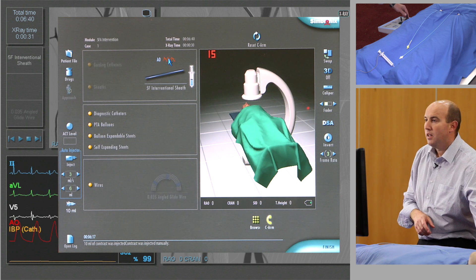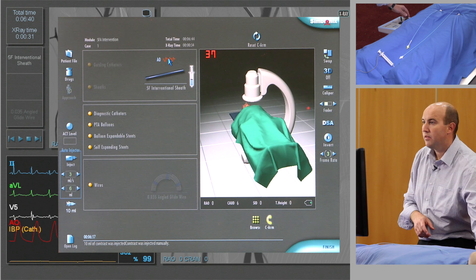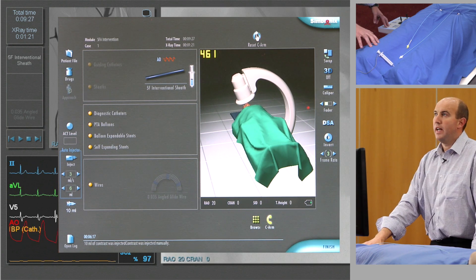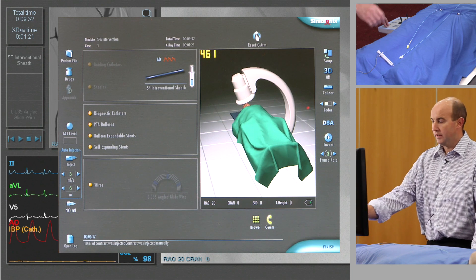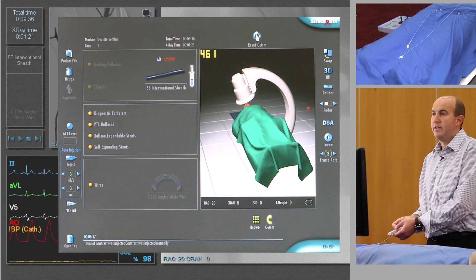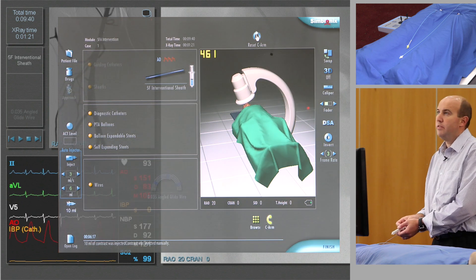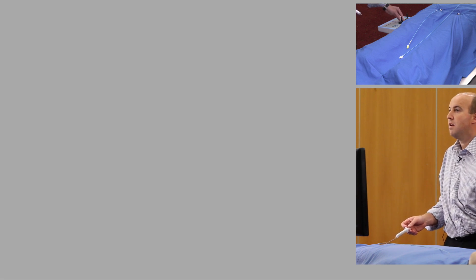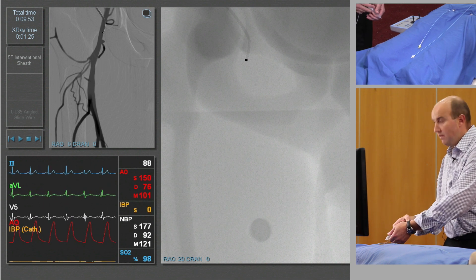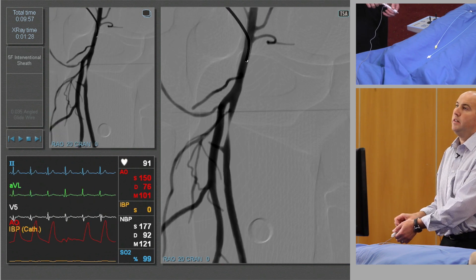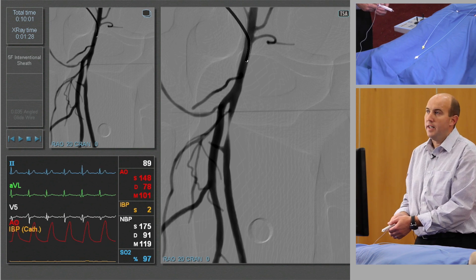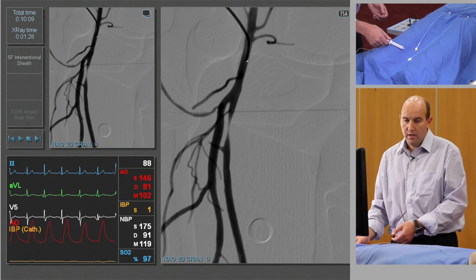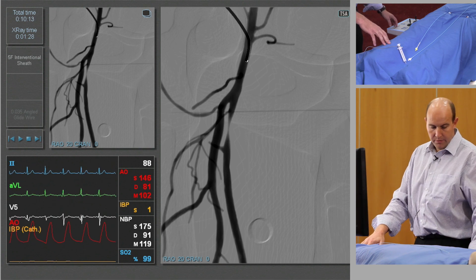We've now just done a diagnostic run in an AP projection, and now we're going to — if you look at the gantry position — we now have 20 degrees of right anterior oblique in order to profile the femoral bifurcation. We do a DSA run, and there you can see disease at the origin of the right SFA, which is not immediately apparent on the AP run. That in itself shows you the benefit of doing an oblique run in the groin.